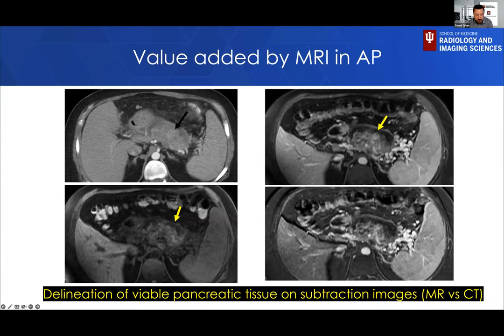When you do an MRI and give contrast, this is the pre-contrast image, and these are the post-contrast images on the right side. It shows that there is enhancing tissue within this collection, meaning that it is not blood or hematoma, it is actually viable pancreatic tissue. So it's good information to give to the surgeon if he or she is planning to do a surgery.